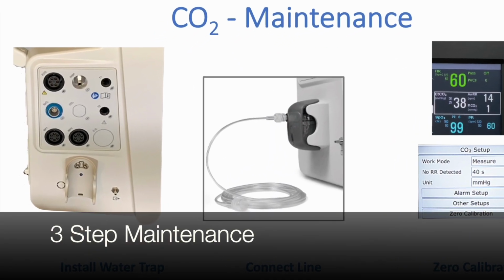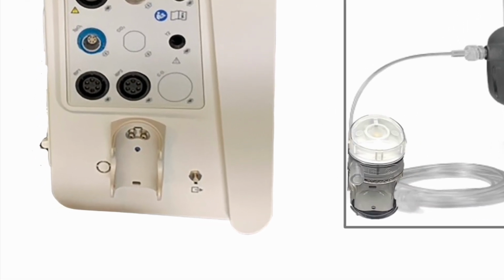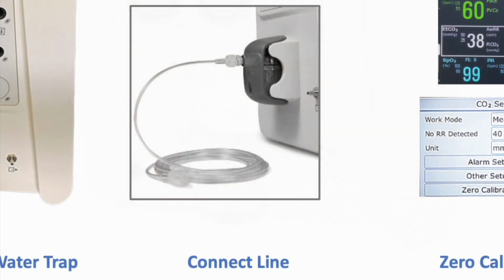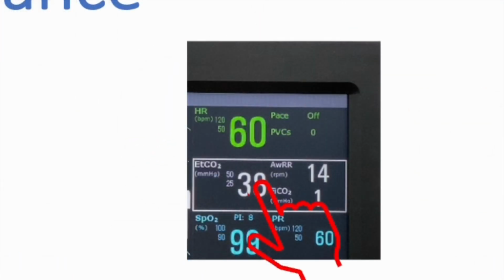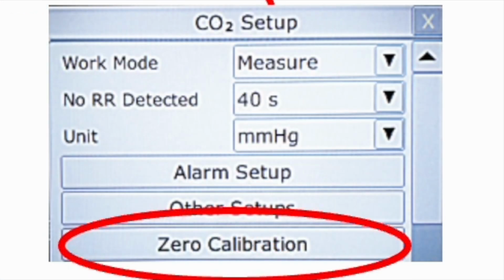Install the water trap on the bottom left side of the monitor by aligning the ports with the prongs on the monitor and snapping it securely in place. Secure the male luer lock of the CO2 line to the water trap. Touch the CO2 parameter square. Touch zero calibrate.